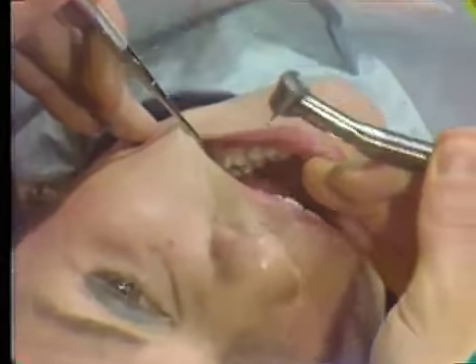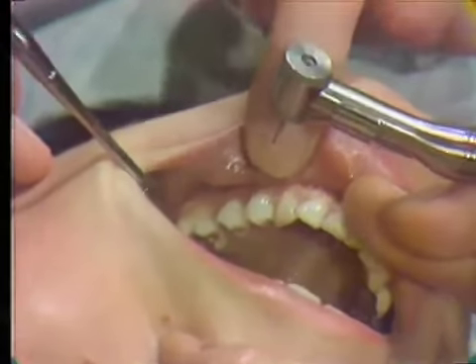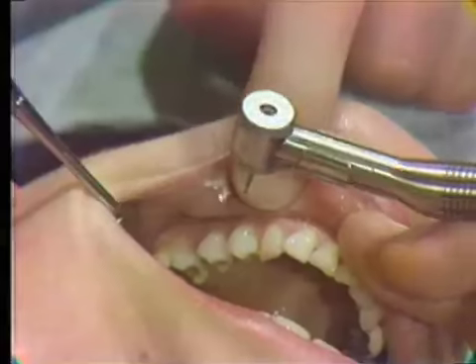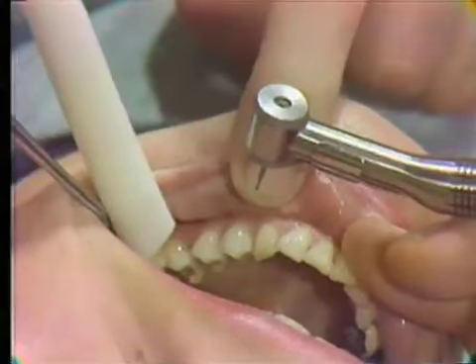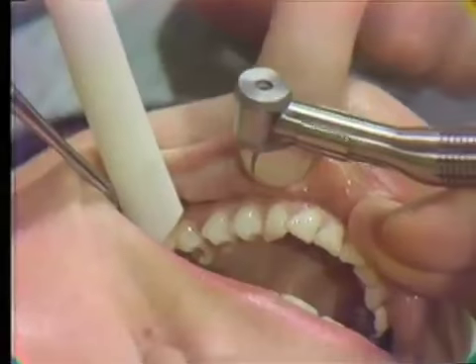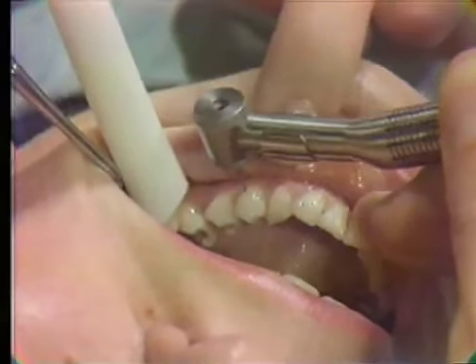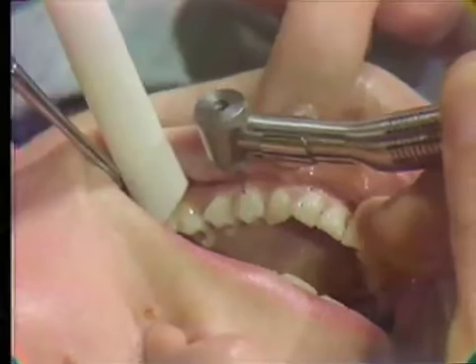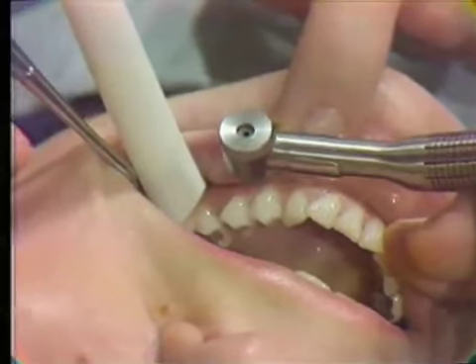Retraction of the patient's left cheek can be accomplished with either the operator's left index finger or with a mouth mirror. The labial surfaces of the anterior teeth provide an excellent finger rest for the operator's right hand. The evacuator tip generally is placed along the buccal aspect of the teeth 1 to 2 teeth posterior to the tooth being treated. The opening of the tip is directed toward the handpiece. In the most posterior areas, intermittent evacuation may be used as fluids accumulate.